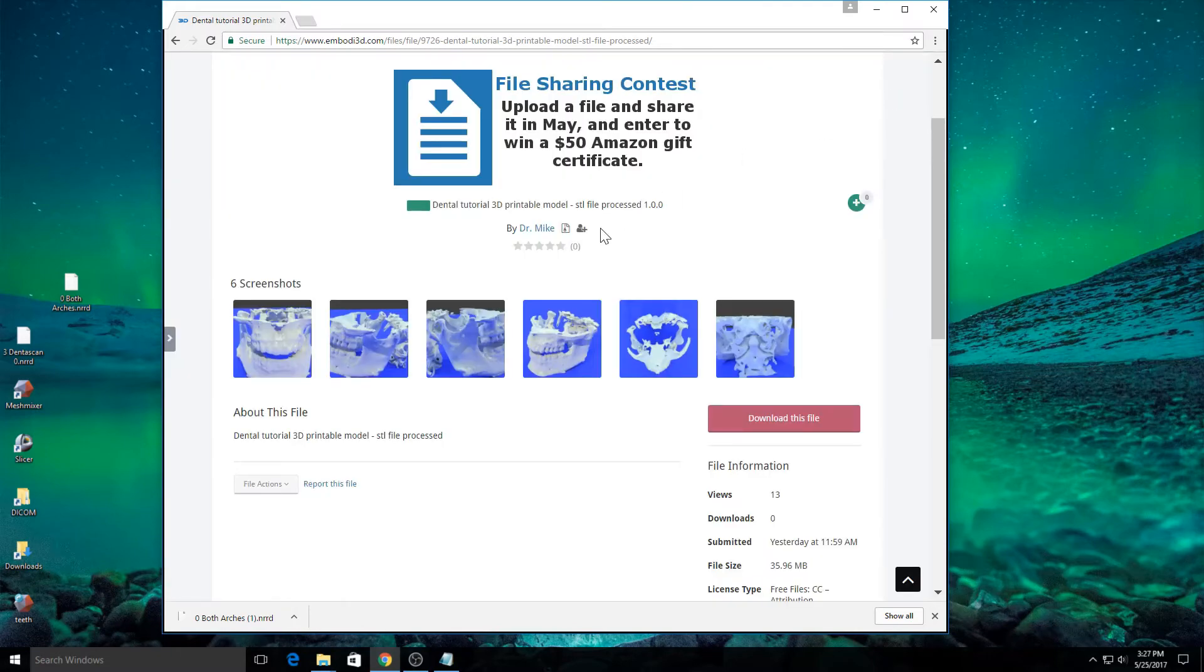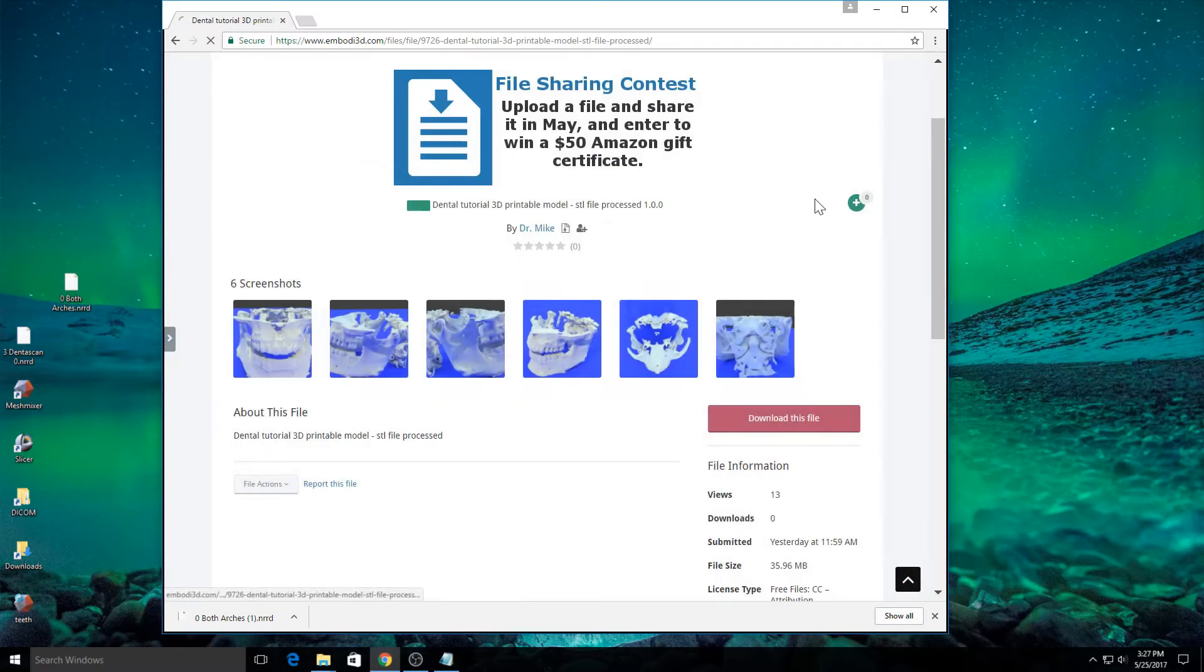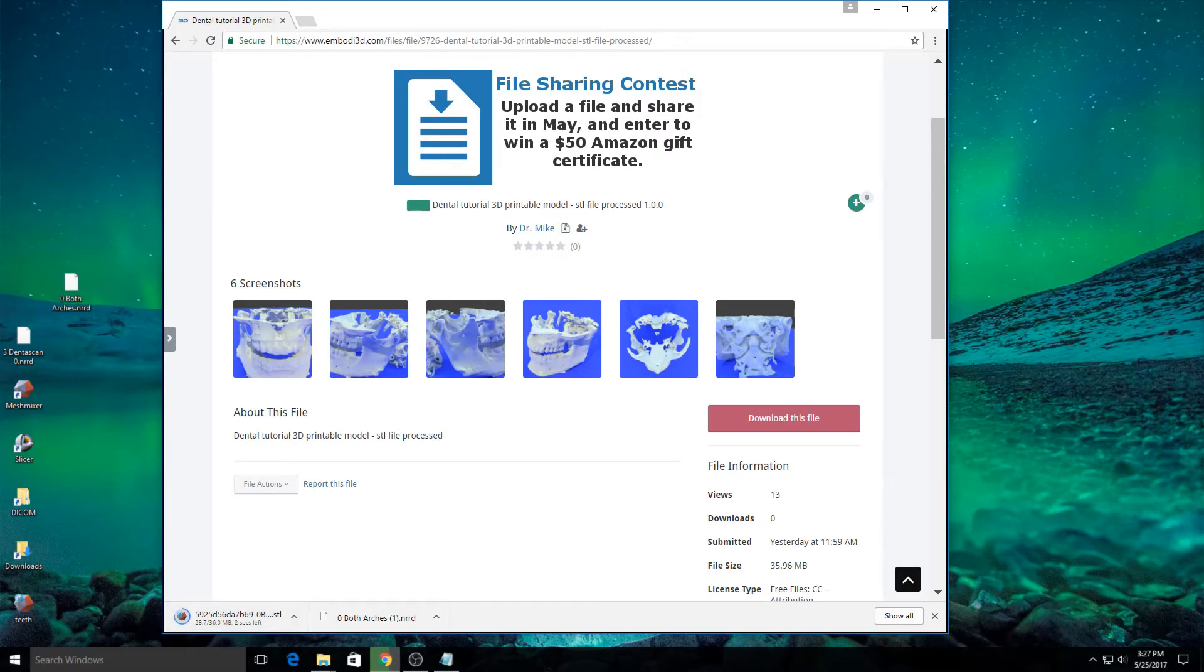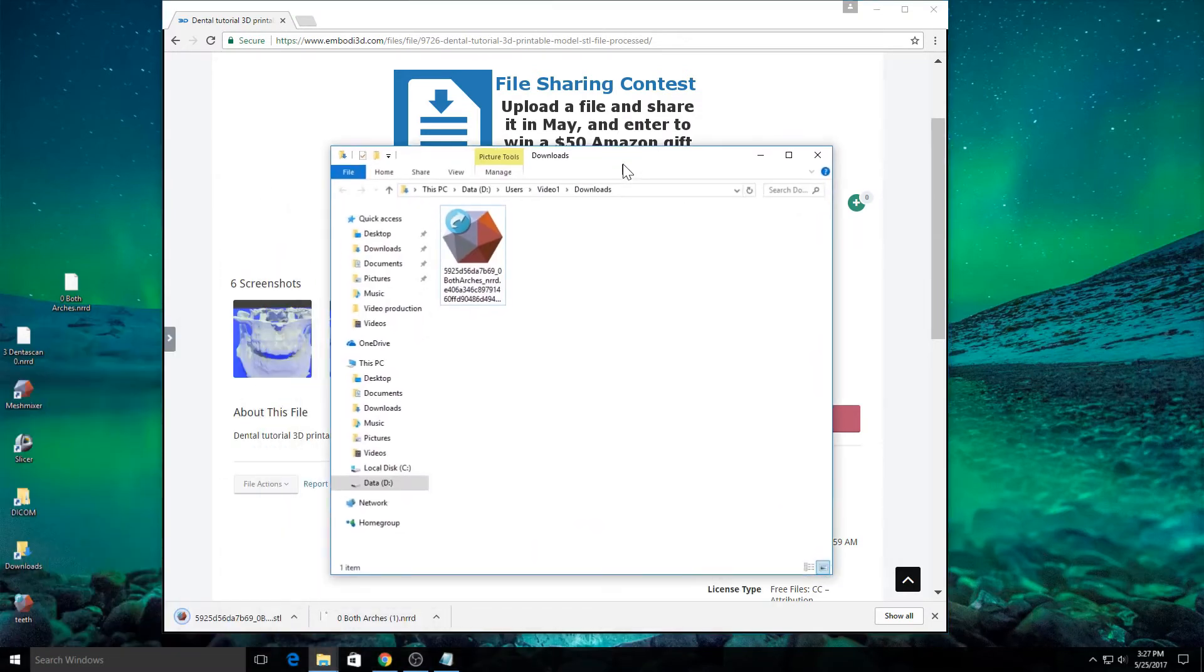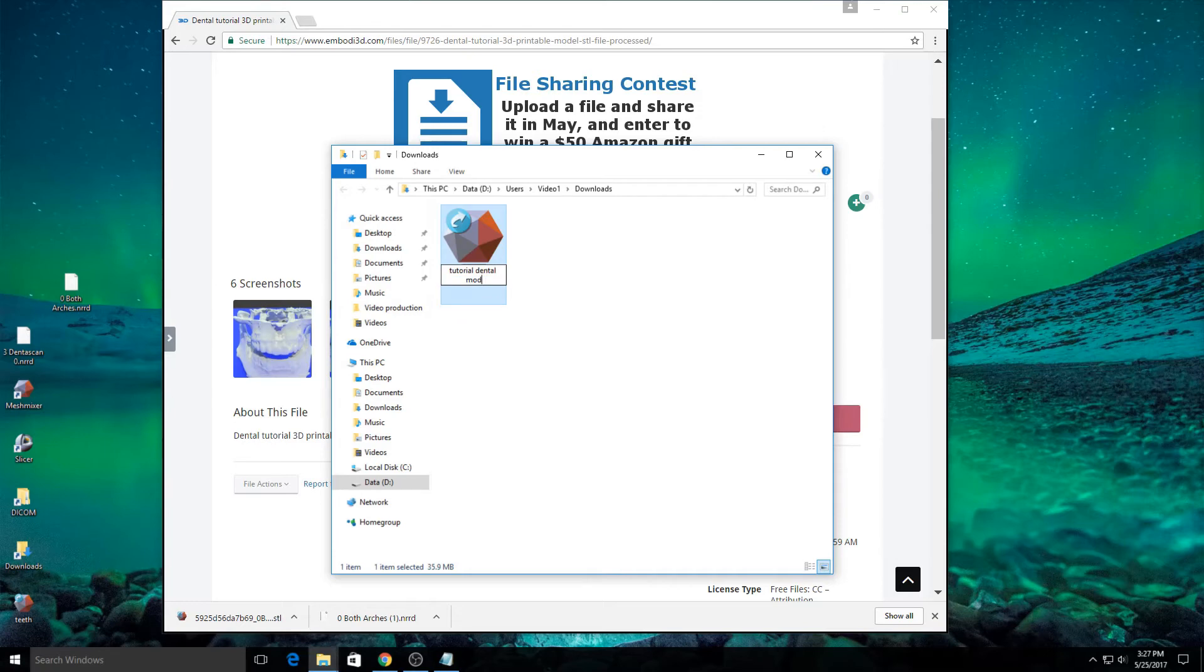That's pretty cool. And when we're ready, we can go ahead and download the file. And our file will be downloaded. And here it is right here. I'm going to change this to tutorial dental model.